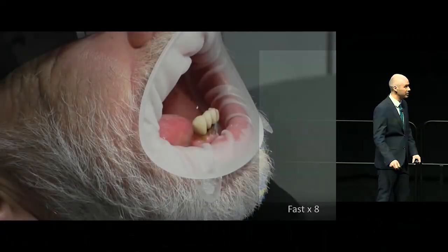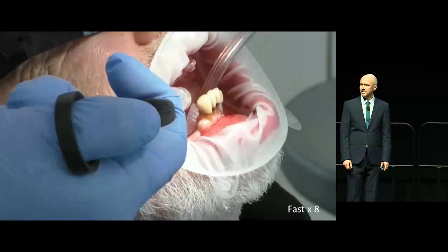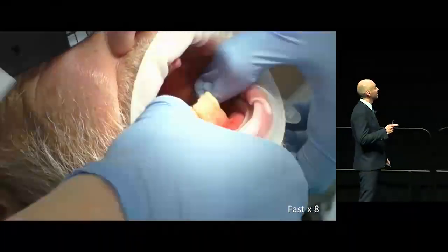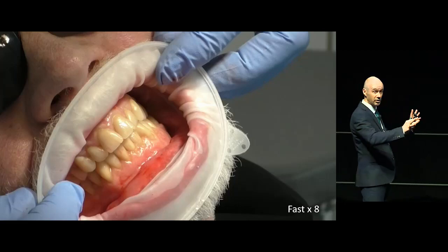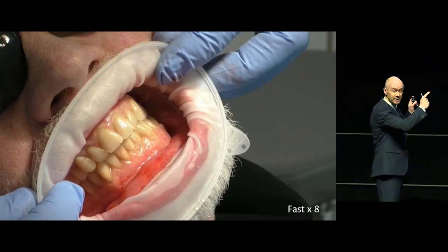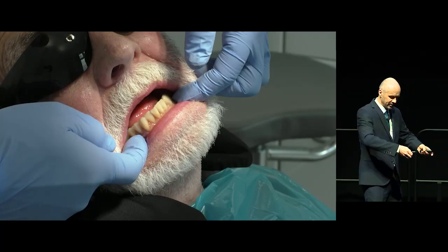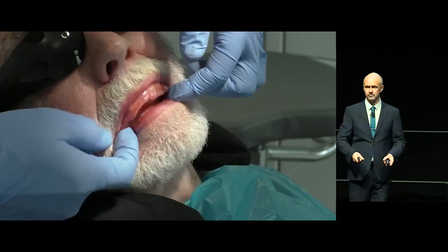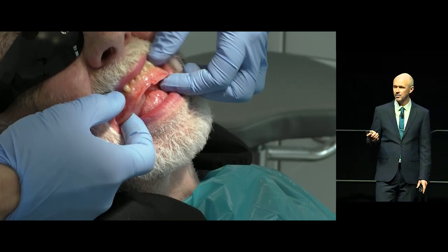So let's have a look at Bert. I'm going to take his lower front teeth out — they were periodontally involved and had caries as well. I've fitted these dentures, so he's got a full lower immediate denture and a full upper denture. I'm taking the Optragate out and trying the lower denture — this is the suction I got on it. After fitting it, there are no implants underneath. That is purely peripheral seal.